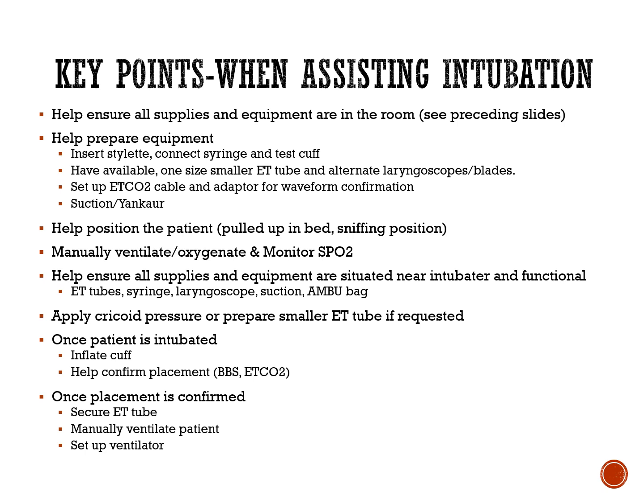Help position the patient, pull them up in bed, a sniffing position, manually ventilate, oxygenate, and monitor the saturation. Help ensure that all supplies and equipment are situated near the intubator and that they're functional.